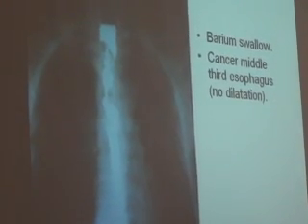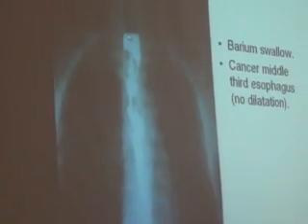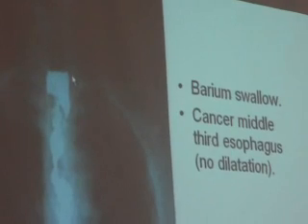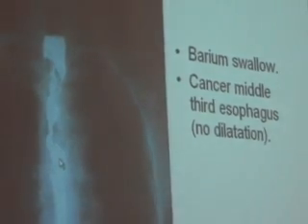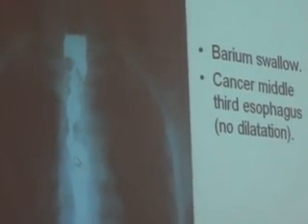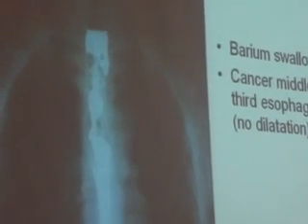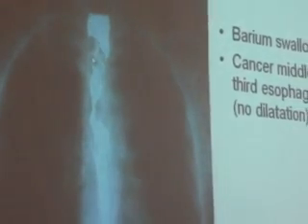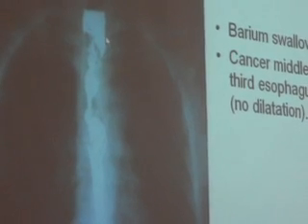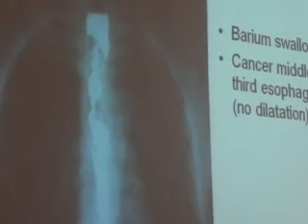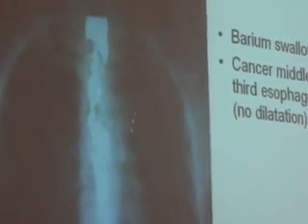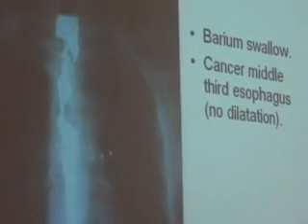Barium swallow showing the esophagus: X-ray finding number one is a fluid level. A fluid level means obstruction — if you find a fluid level in the esophagus, it equals obstruction with fluid and barium level. There is shouldering and an irregular stricture at the middle of the esophagus. This is the upper third, this is the middle third, and this is the lower third — cancer of the middle third esophagus.